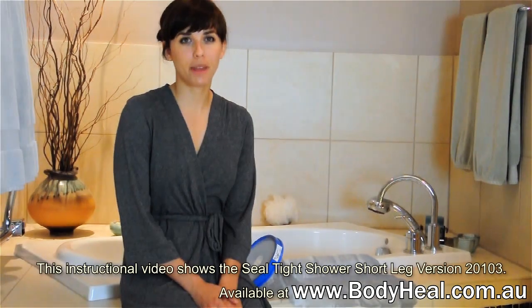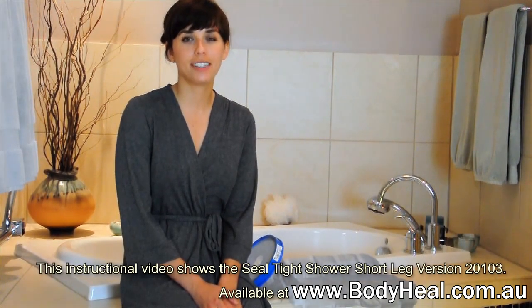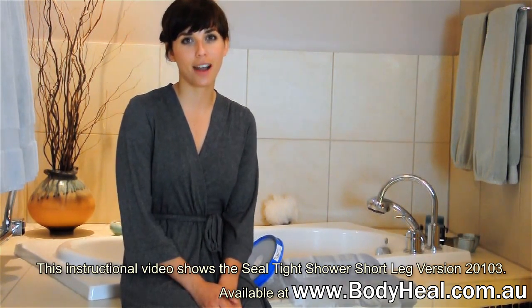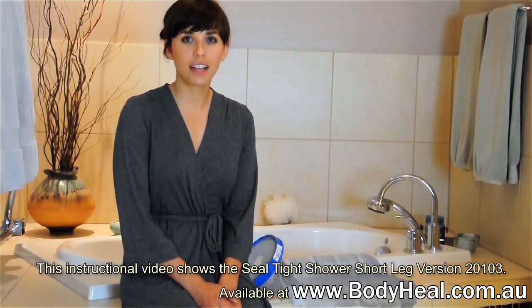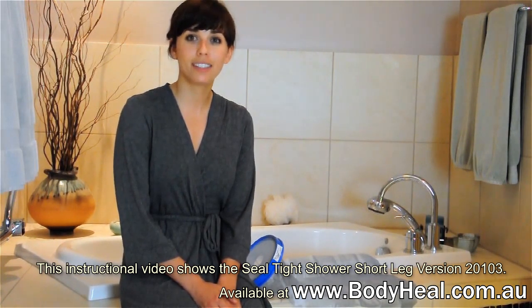If daily bathing with your cast or bandage has become a chore, you'll be happy to know that Sealtight Original is the easy, durable way to stay dry. With pediatric and adult sizes available, Sealtight Original is designed with simplicity in mind.